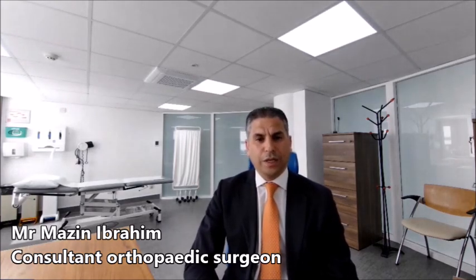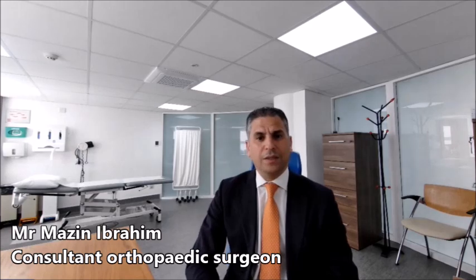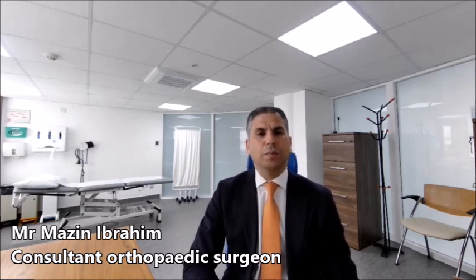Knee replacement surgery is designed to remove these worn out surfaces and replace them with metal, and replace the structures in between with a plastic. So it's a metal and a plastic implant within the knee designed to replace the worn out surfaces.